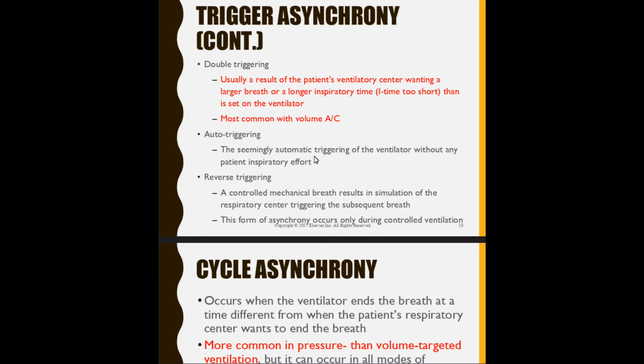Now don't get this confused with a mandatory breath. Okay, a mandatory breath is given to the patient without any patient inspiratory effort. It's triggered by the machine. But don't think that is a form of auto-triggering.